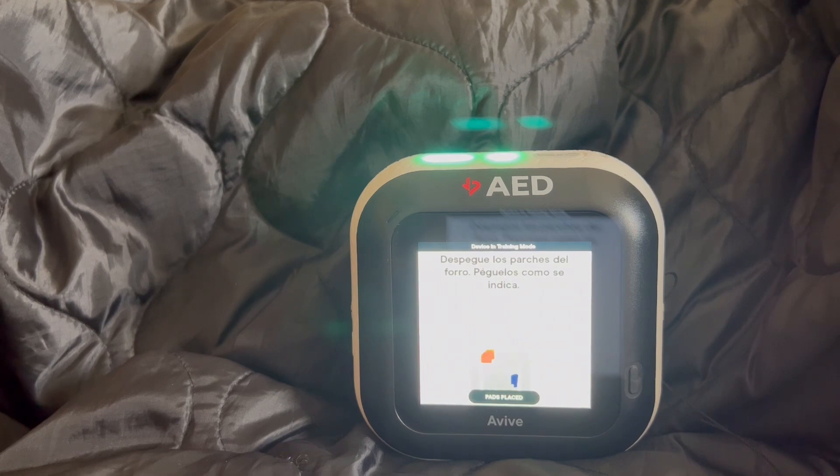Despegue el parche rojo del forro blanco y péguelo firmemente sobre la piel del paciente, exactamente como se indica. Despegue el parche azul del forro blanco y péguelo firmemente sobre la piel del paciente, exactamente como se indica.